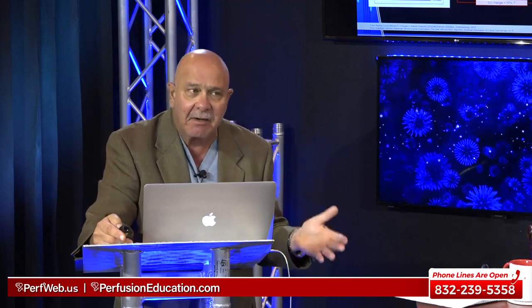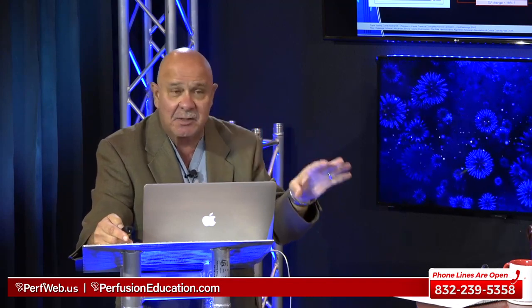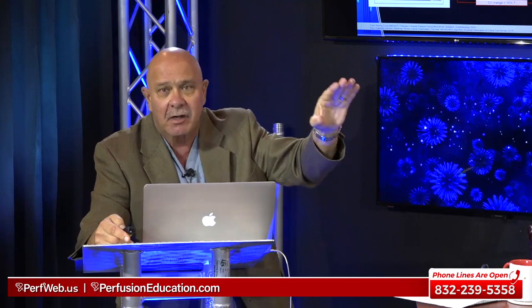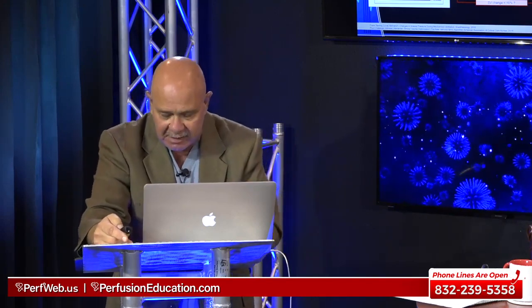So it's very helpful to look at stroke volume variation electronically, because by the eye, when it's profound, you can see it. It's easy. But when it gets narrower and narrower, when you want to optimize, fine-tune, you really want to use that stroke volume variation program that exists within this monitor.